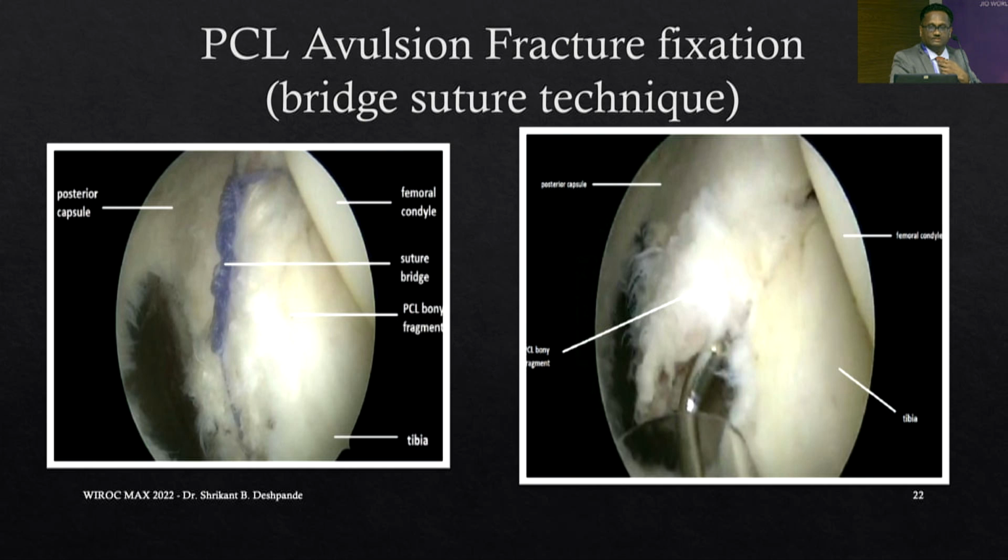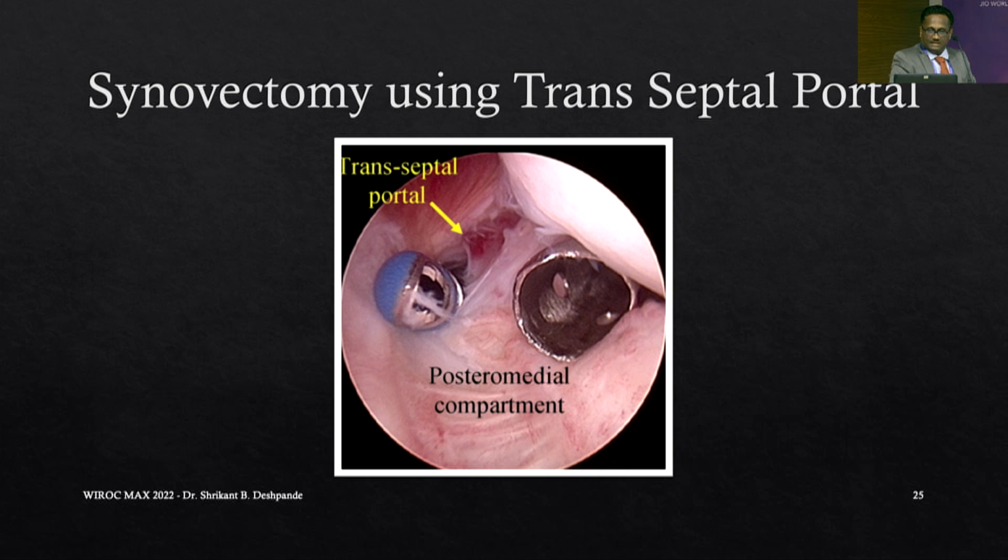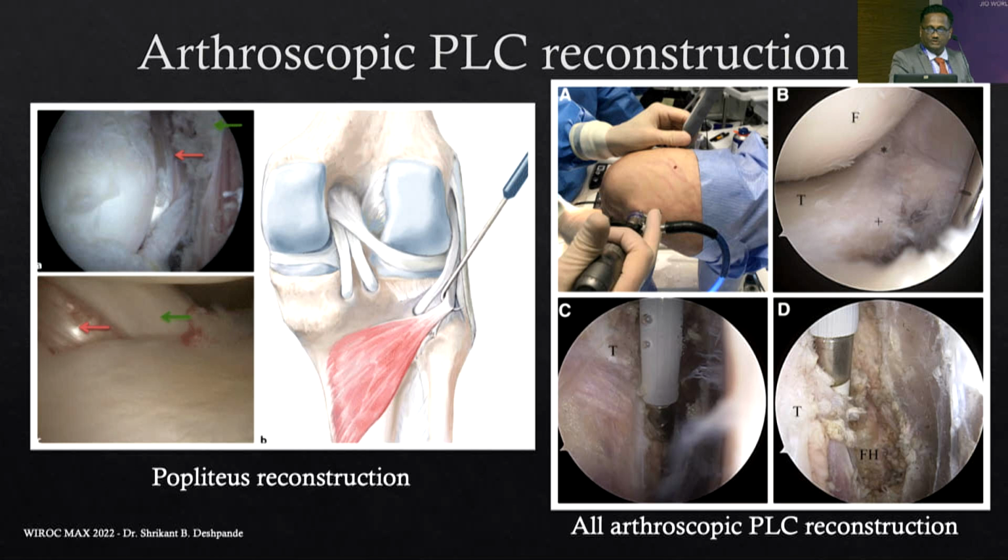These are some uses of the posterior portals: PCL avulsion fixation, suture bridge technique. Next speaker is going to speak about that. Ramp lesion repairs, posterior compartment synovectomy, as you can see here. Synovectomy using transseptal portal, then loose body excision, arthroscopic PLC reconstruction.